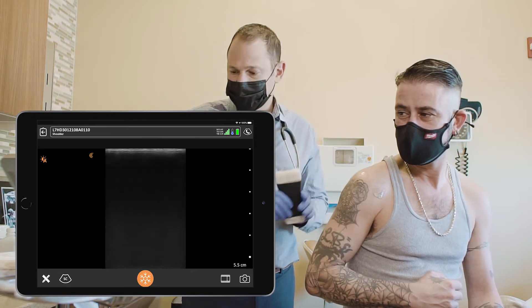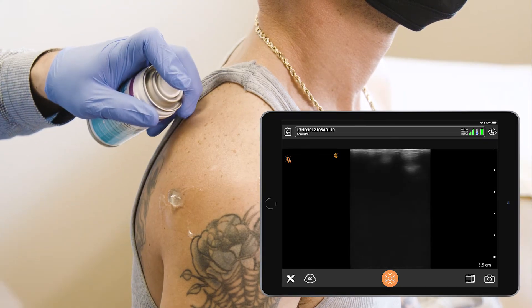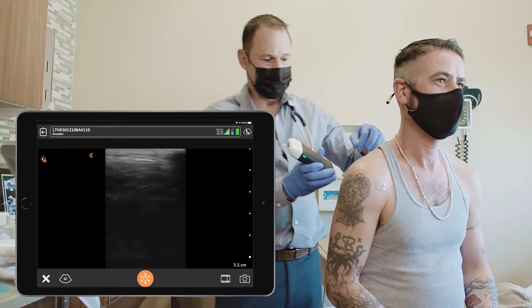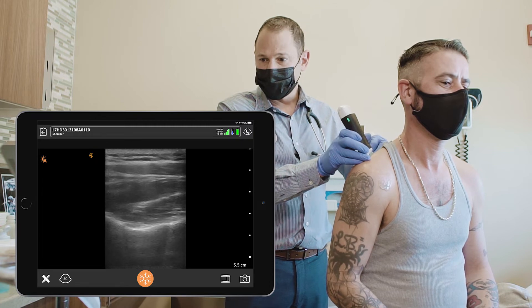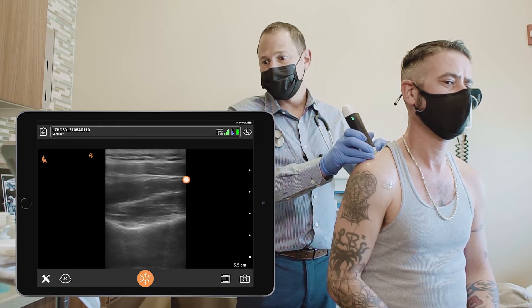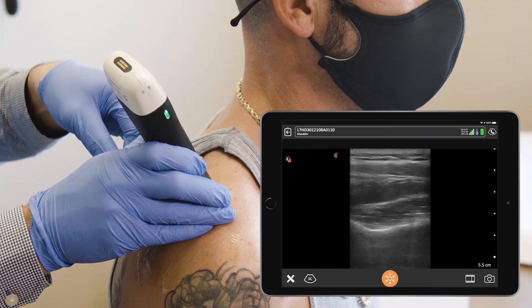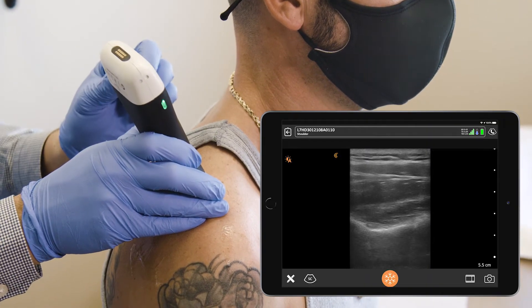Now we're going to find the suprascapular nerve and perform a suprascapular nerve block. The first muscle layer is trapezius, and the supraspinatus is underneath. The suprascapular nerve is under the transverse scapular notch, and there's a blood vessel next to the nerve which you may or may not see.